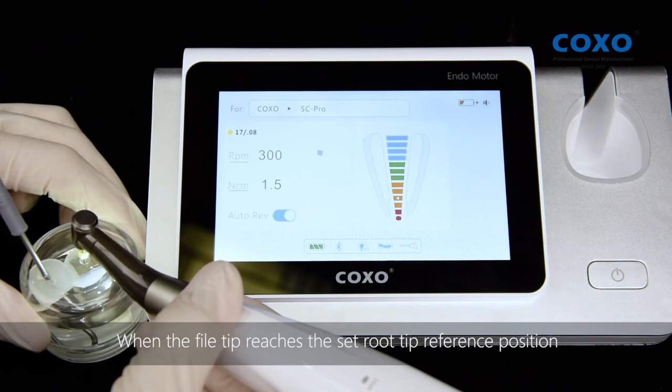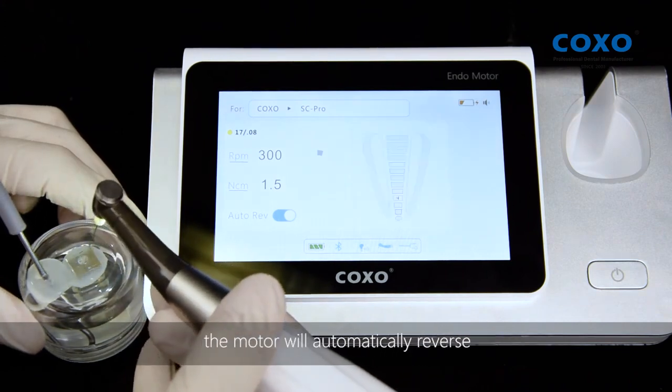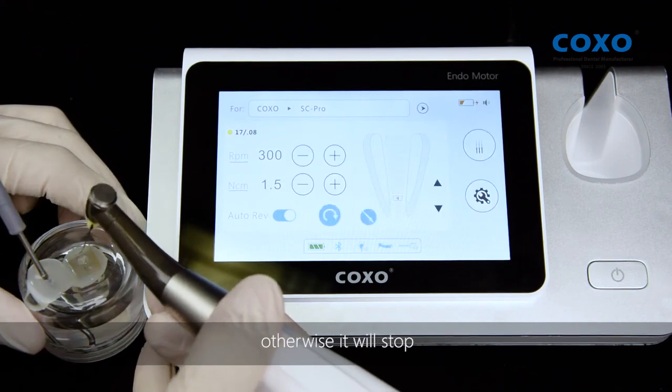When the file tip reaches the set root tip reference position, if the automatic reverse function is turned on, the motor will automatically reverse; otherwise it will stop.